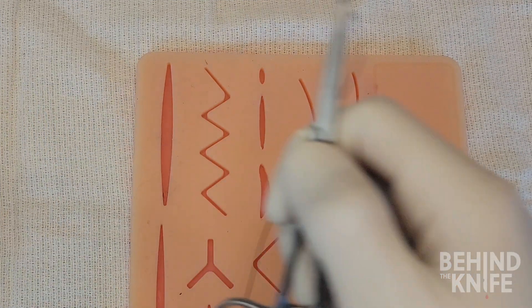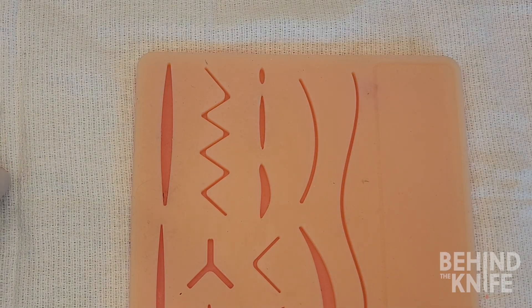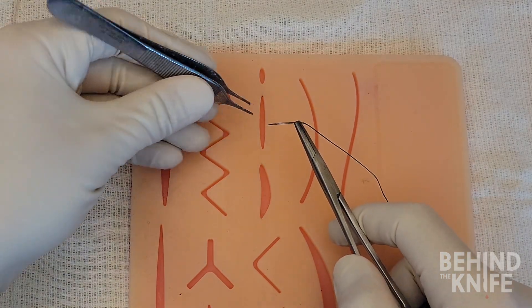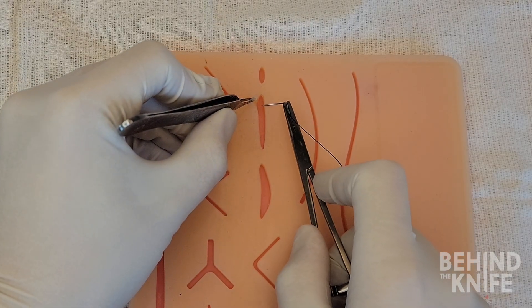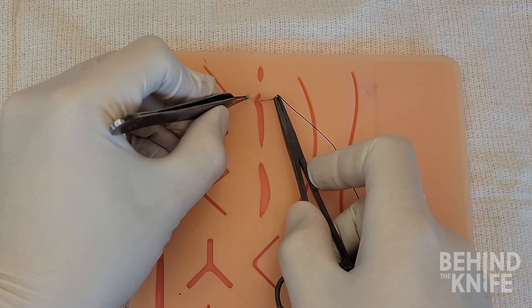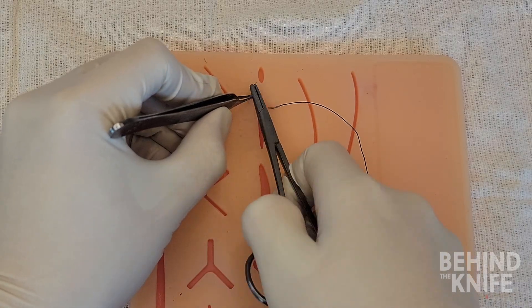We're going to start by picking up our needle drivers and loading our needle into them in the orientation for a forehand throw. The first step involves placing an anchoring stitch about one to two millimeters away from the top of the wound and securing it with a knot.